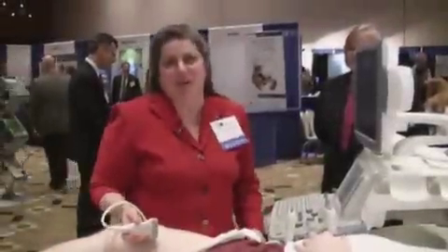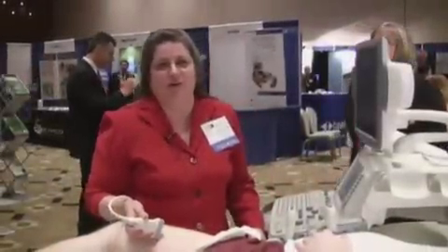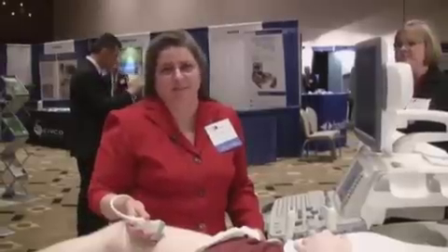Hello, my name's Anne-Marie Kopinski, and I'm going to take you through doing a lower extremity arterial duplex ultrasound exam.